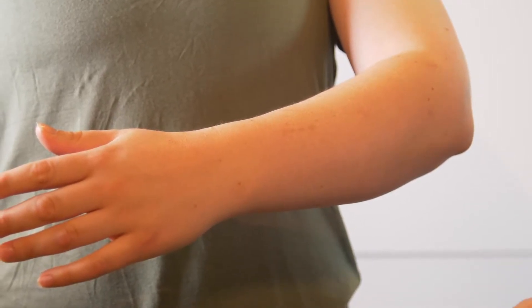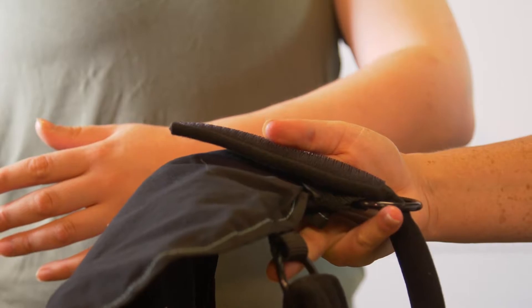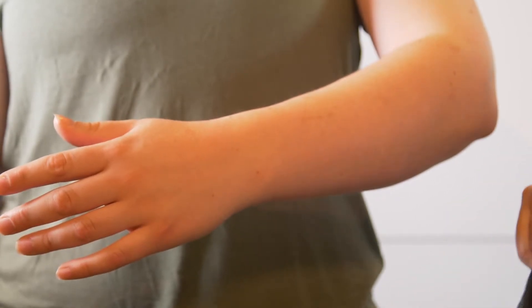To apply the arm sling, start by attaching the longest strap to the ring at the bottom of the closed end of the sling. Next, attach the second strap to the ring at the top of the closed end of the sling.